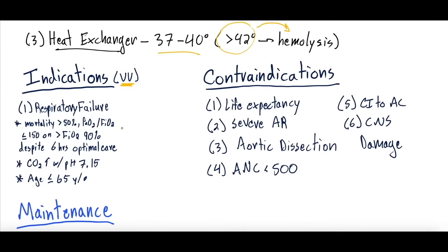People have put forth some kind of numerical indication numbers, but these are not followed absolutely. So there's some subjectivity to deciding who is a candidate for and should require ECMO. But in general, you can think of it this way. This is a helpful guide.